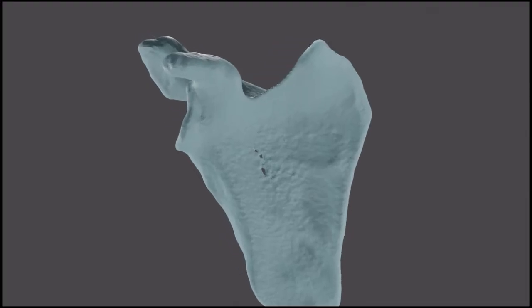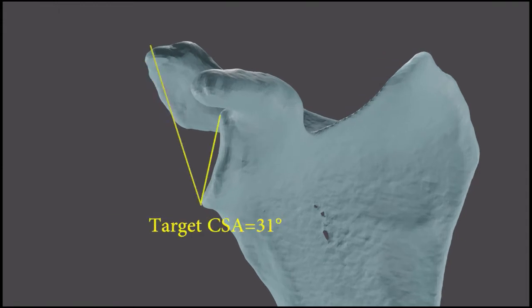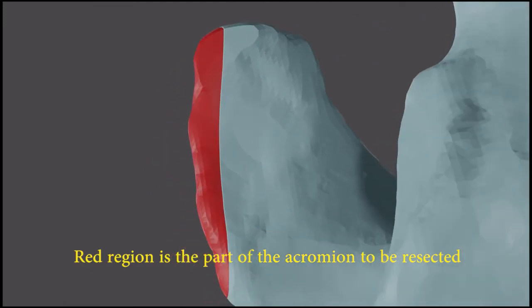This demo shows the preoperative 3D planning. The preoperative CSA is measured on the standard anterior view, and the target CSA is set at 31 degrees. And then a cutting plane is established and positioned at the measuring line of 31 degrees. And the red region outside the cutting plane is the part of the bone to be removed.